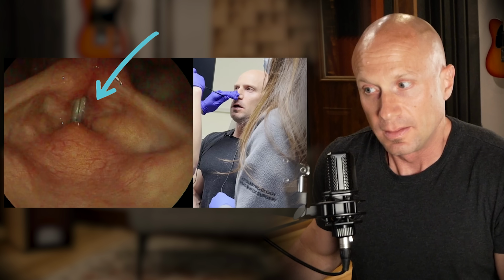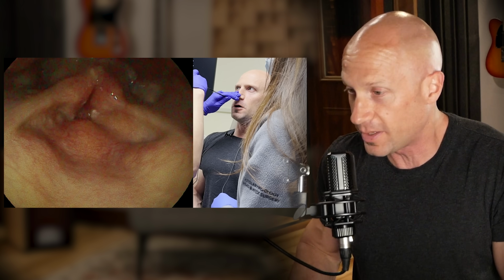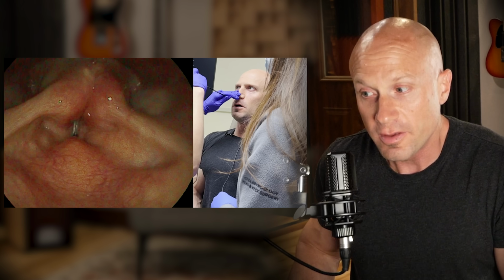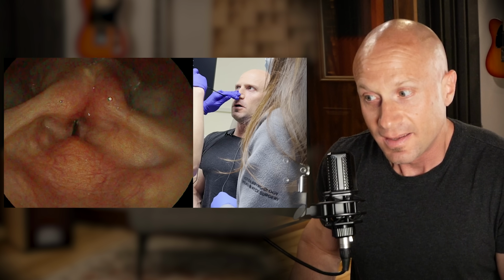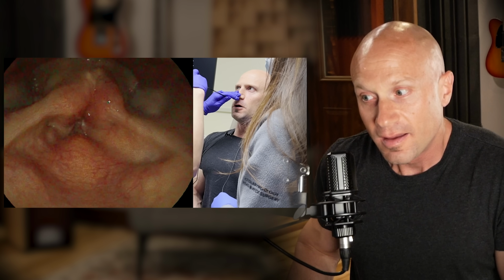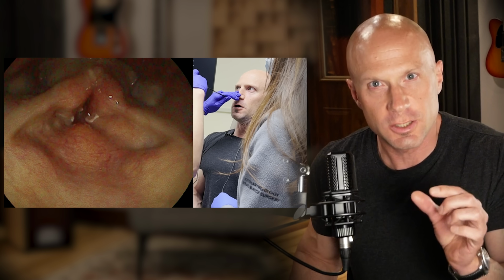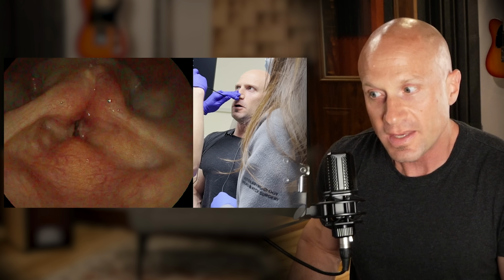Watch what happens. The vocal tract isn't quite fully constricted, but you can see down in this little hole here, if I back up, look, see what the false cords are doing? The vocal cords are going to disengage. And then you can see as I move it in slow motion, the false cords are doing this. Let's listen to that part again. There was that brief part where I was distorted singing, and you saw the vocal cords still engaged behind the false cords, and then they disengage.